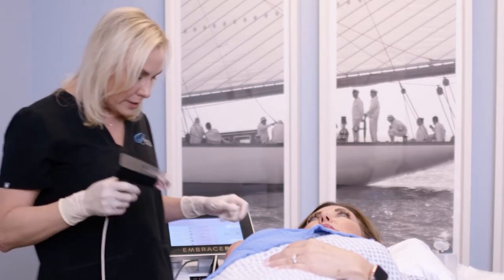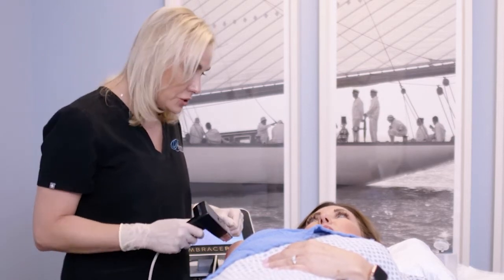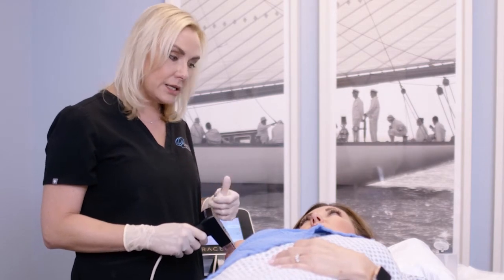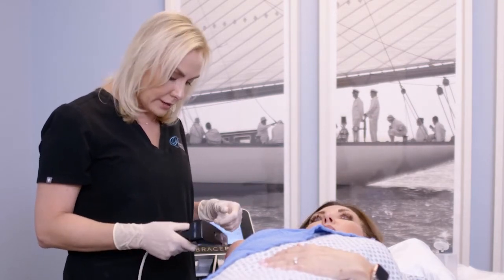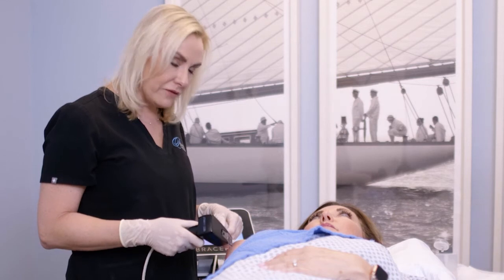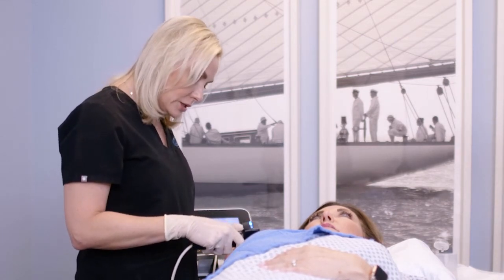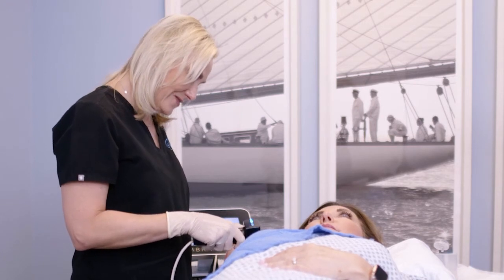So we're going to be in the dermis right now, so that'll tighten up a lot of the collagen. This is great for crepiness of the skin. It's great for skin laxity. And like we said, at that deeper level, it's going to actually help to melt the fat as well. So we're going to start on this pass. Let us know if there's any questions. You doing okay? Mm-hmm. Good job.